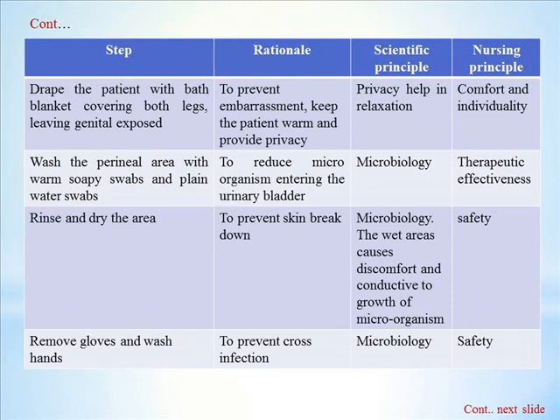Then we have to drape the patient with a bath blanket covering both legs, leaving the genitals exposed, in order to provide comfort and prevent unnecessary embarrassment and exposure of the patient.